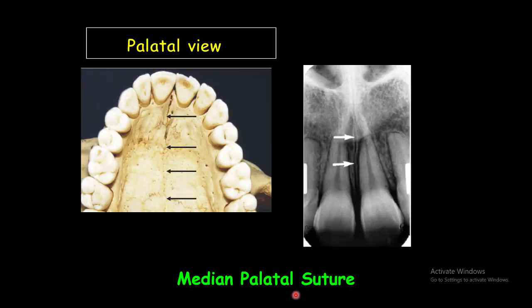The median palatine suture, also called the intermaxillary suture, is formed by the palatine processes that articulate in the midline. On intraoral periapical radiography, this suture appears as a thin radiolucent line in the midline, extending from the alveolar crest between the central incisors and continuing posteriorly. This suture is limited by two radiopaque borders of thin cortical bone on each side. Evaluation of the intermaxillary suture is important in planning for orthodontic expansion of the palate.